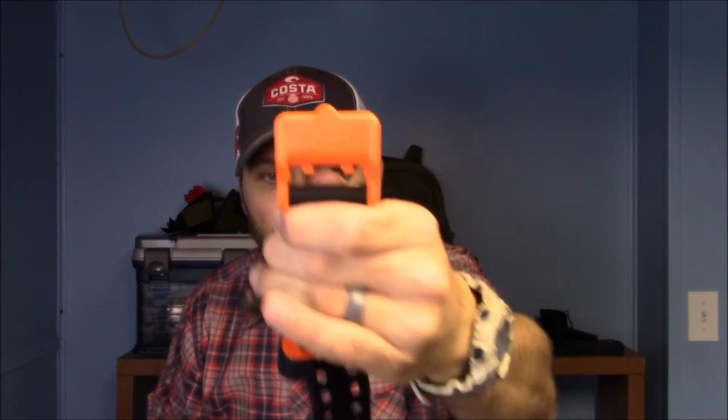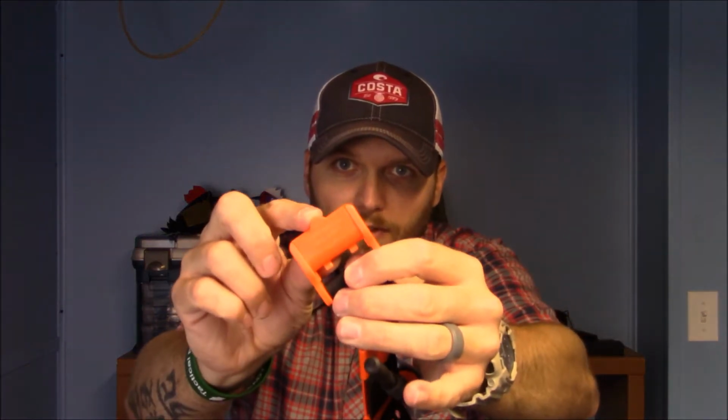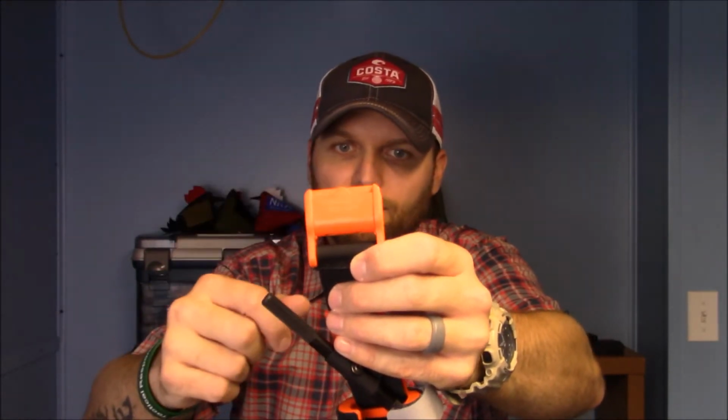So you can see there, it's just this rounded edge there. Now if you listen, you hear that click? That part pushes down and these two teeth pop out. And that's what holds this Velcro in place. So this Velcro is basically just there to keep the excess from flopping around. The way you release this, you'll see this little tab right here. Push up on that tab and it releases, and those teeth retract back inside of this device here.